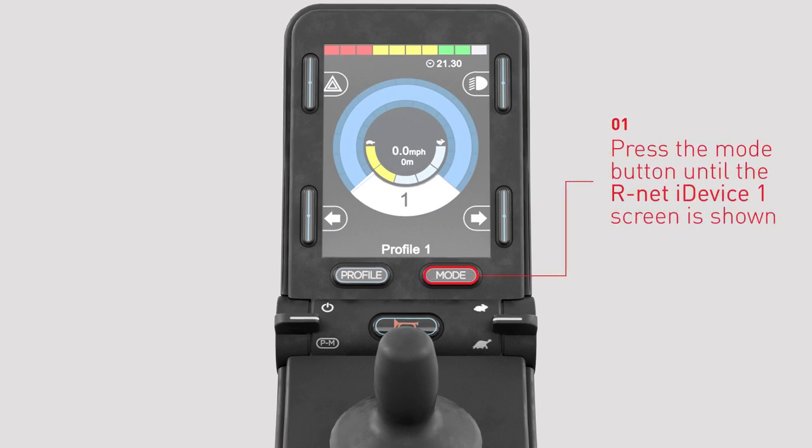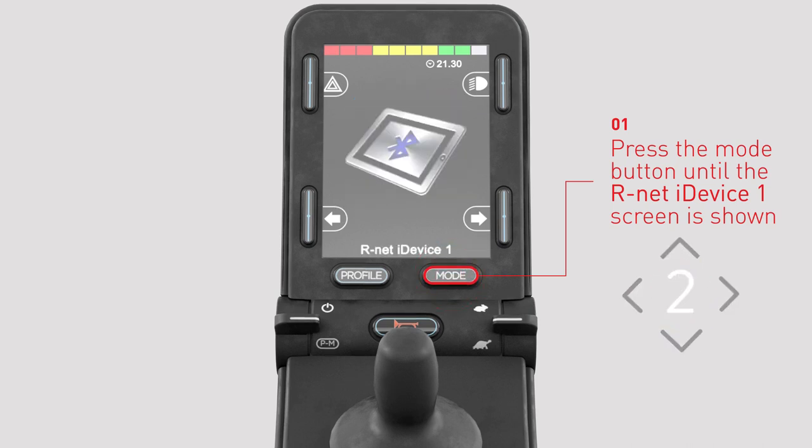Enter Bluetooth mode on R-Net by pressing the mode button several times until R-Net iDevice 1 is shown on the joystick LCD screen.